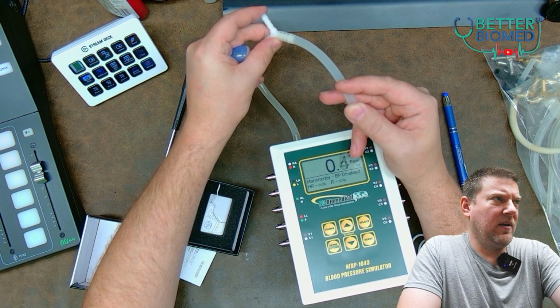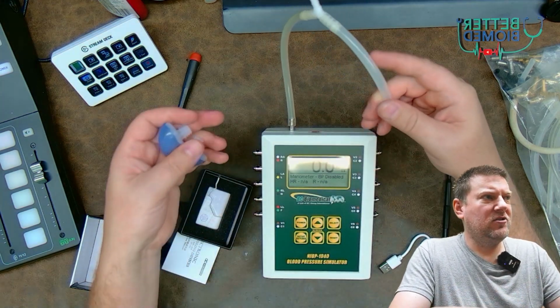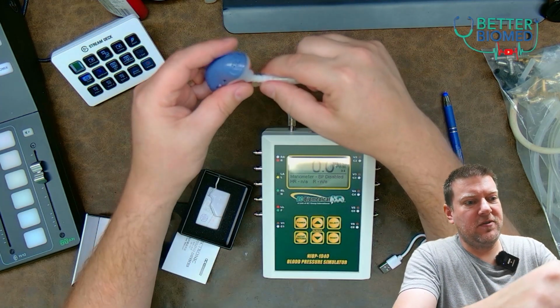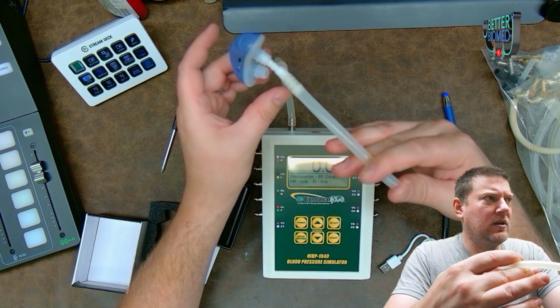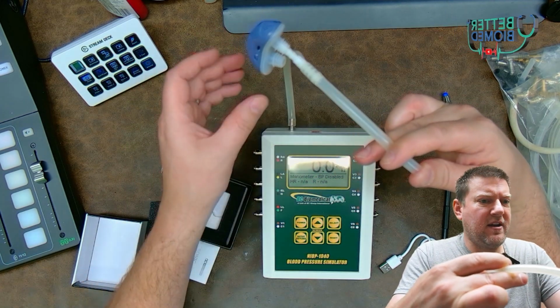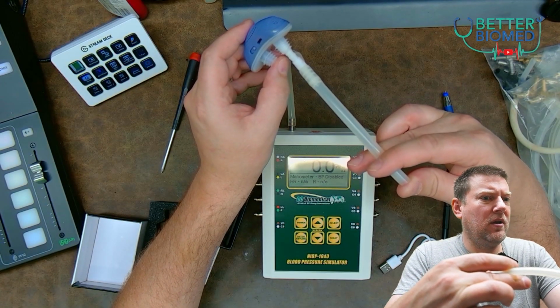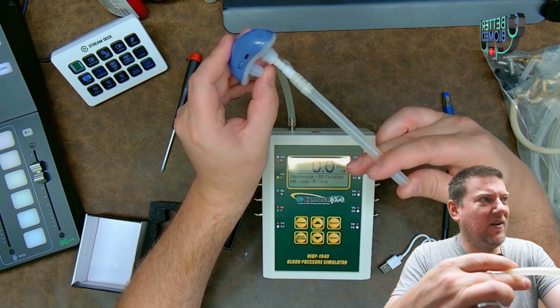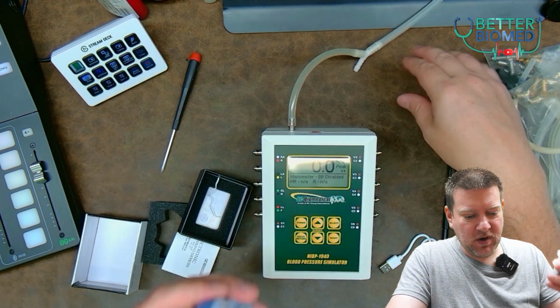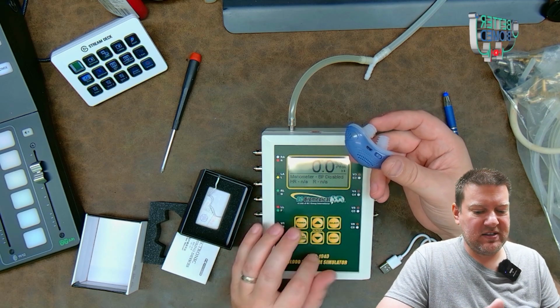Look at that. I'm barely putting my finger on the tip, and it's going up in small increments. So if I put this guy in here, and I occlude it for one nostril, I have nothing. If I occlude two nostrils, it doesn't register a thing. Okay, so clearly what we are going to do next is go ahead and charge this guy. We're gonna give it a fighting chance.